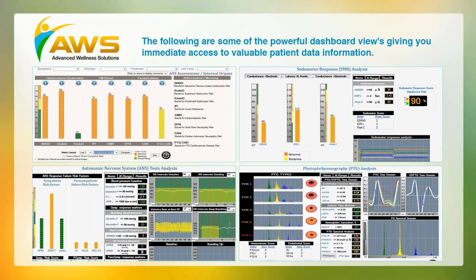On the lower left section there, this talks about how the patient's heart responds in the area of rhythm and electrical stability to different types of pressure that's applied during the test. R-R intervals during the Valsalva, where you plug your nose and hold your breath. Standing at the end of the test, which surprisingly enough, a simple move from sitting to standing can show up dynamic important information. And then the beat evaluation, which is at the very beginning of the test on a baseline, and how it compares to these other three.